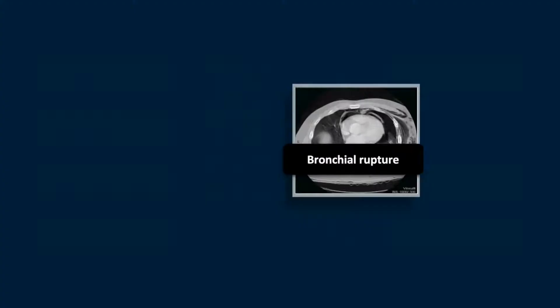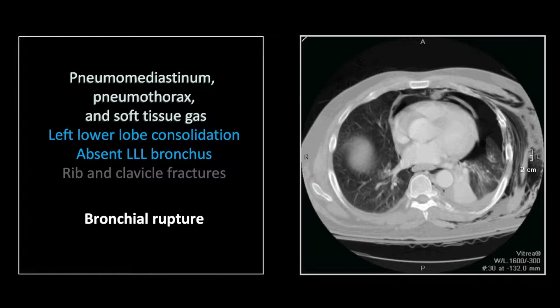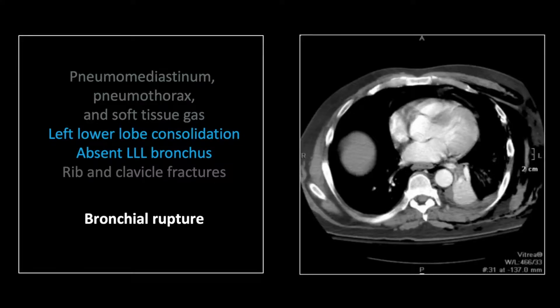Our next case is a bronchial rupture. There is again extensive extrathoracic soft tissue gas, a large pneumothorax on the left, and significant pneumomediastinum. In addition, there is volume loss and near complete consolidation of the left lower lobe, with only tiny bits of air bronchogram visible. You are also unable to track the left lower lobe bronchus in the left infrahilar region — all of this adds up to a bronchial rupture.